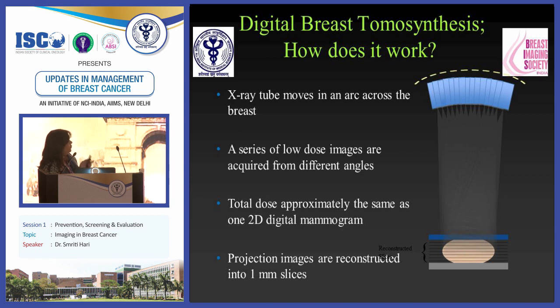The total dose of tomosynthesis is approximately the same as the 2D digital mammogram. So together, that will be twice the dose.